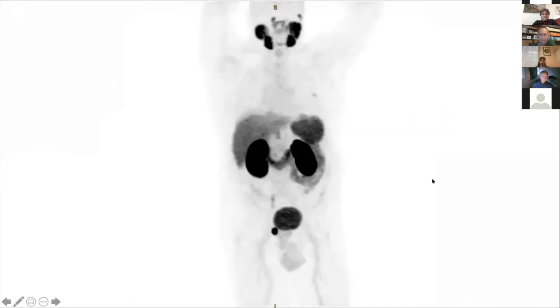Okay. So just to give people who may not be so familiar with PSMA PET scanning what it typically looks like, you've got a whole lot of normal uptake in kidneys, spleen, liver, bowel, salivary and lacrimal glands. So that's what we're seeing here. We're even seeing a little bit of uptake coming down the right ureter here, and of course, radiotracer in the bladder here. But beautifully shown is that exact same lesion that we saw just on the MRI. So it's showing up the primary extremely well as well. And of course, there's data showing that PSMA PET's pretty good for primary diagnosis as well as staging. But I just wanted to show you what that looked like on a PSMA PET.